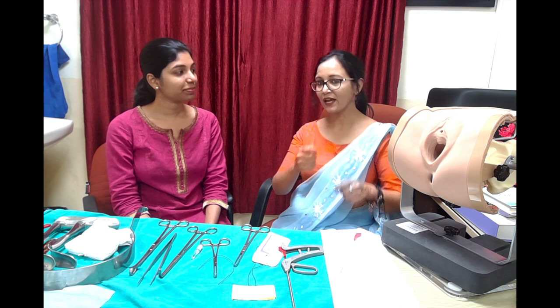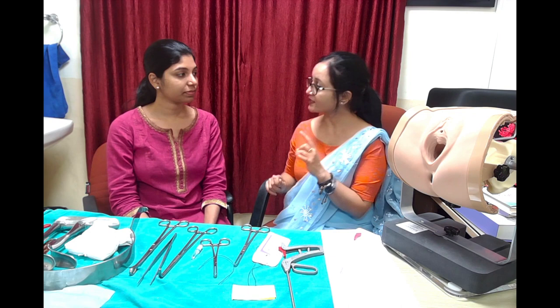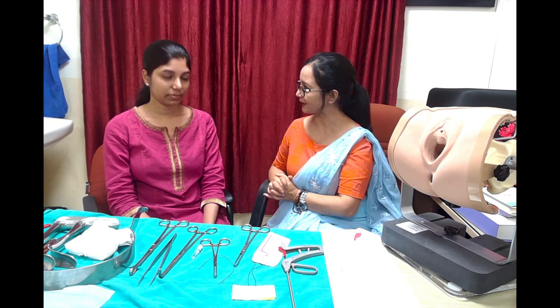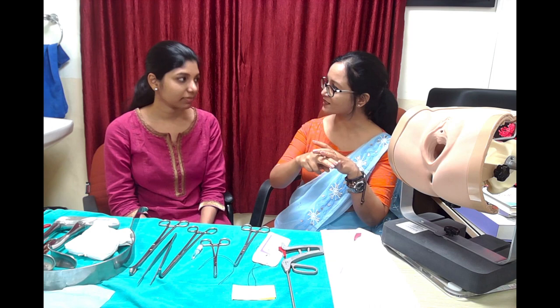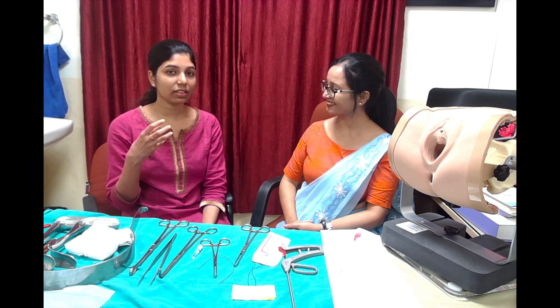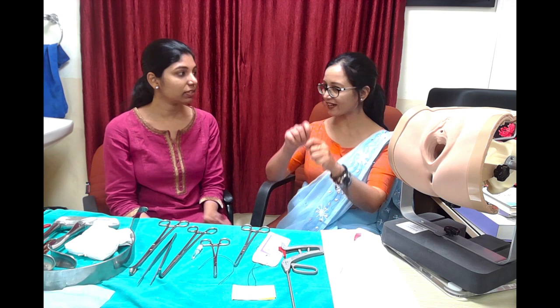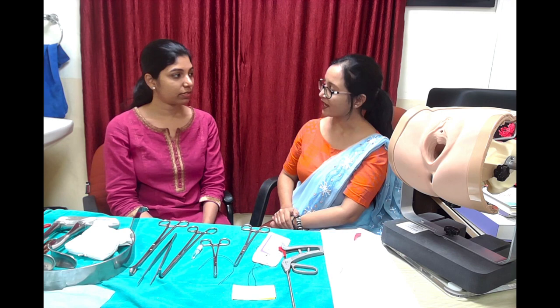To fix the sutures to the vault, take the needle and with a needle holder take a bite through the vaginal wall. If using absorbable suture, a full-thickness bite is acceptable. If using non-absorbable suture, take the bite only in the sub-epithelial tissue so the suture does not come through the vaginal mucosa. Do not tie the sutures yet — the vault must go inside first.